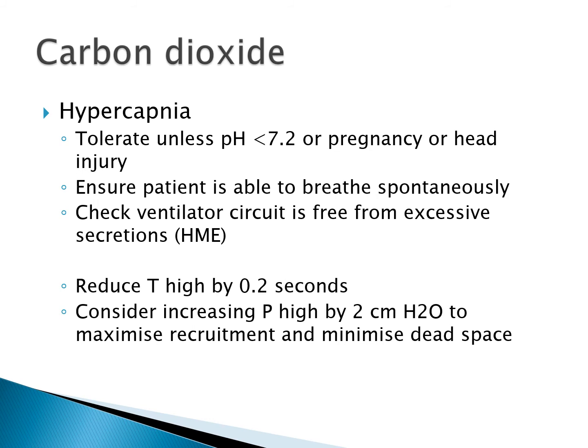For carbon dioxide then, I would tolerate hypercapnia unless your pH is getting into that acidotic range or you've got a pregnant patient or a patient with a head injury. I would make sure that my patient is able to breathe spontaneously. Have we been bolusing sedation and rendering them apneic? I would also then check my ventilator circuit is free from excessive secretions. The heat and moisture exchange filter is a classic place for getting clogged up.